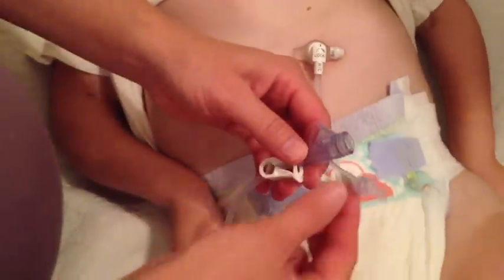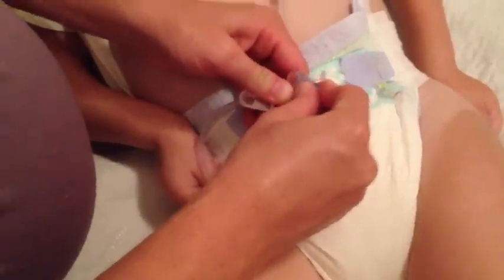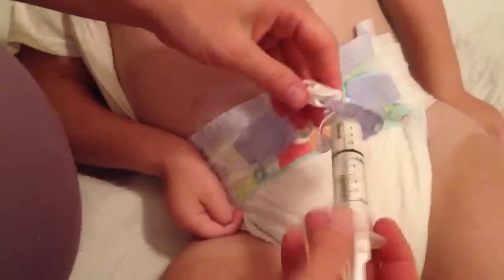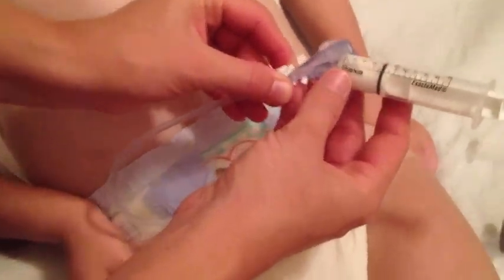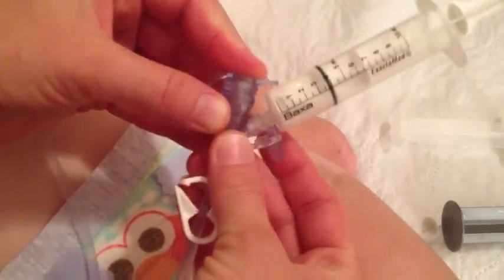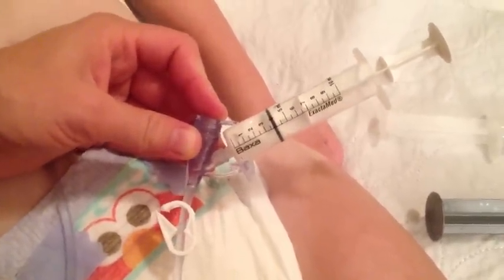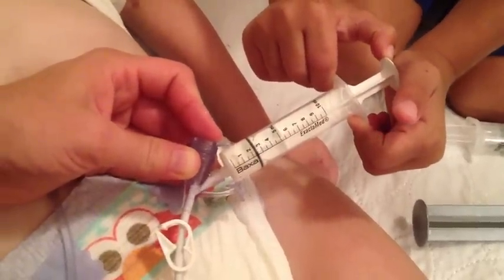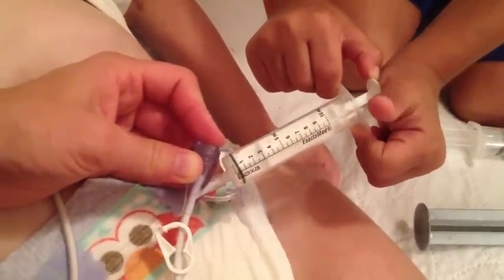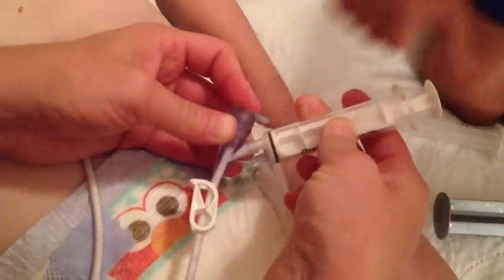Once that's ready, get the medicine — you can start with either the liquid or the mixed powder. Put it in the little small port, open the clamp, and put the white liquid medicine into the tube. Caden will demonstrate how it's to be done — nice and slow and even. Then clamp it and take that one out.